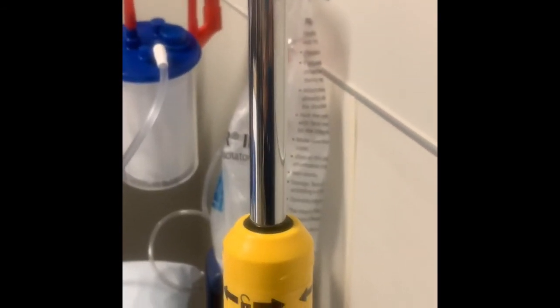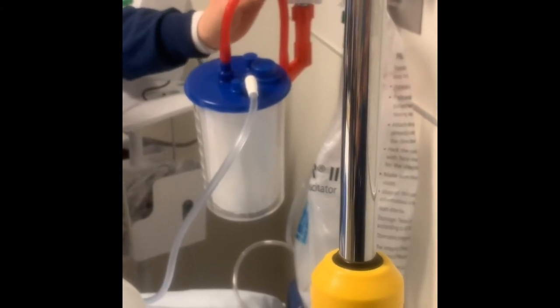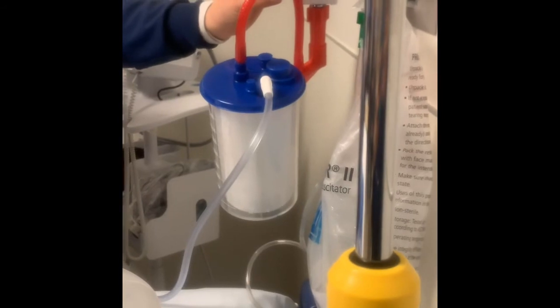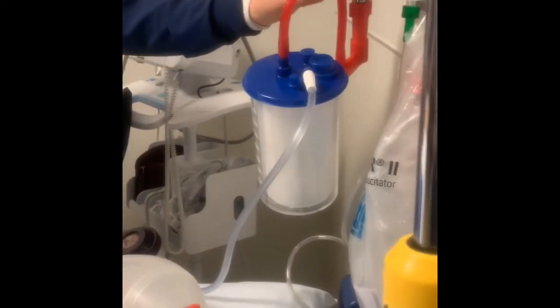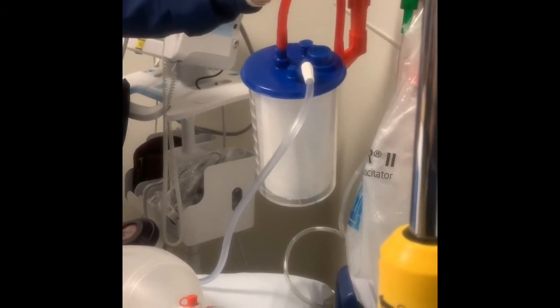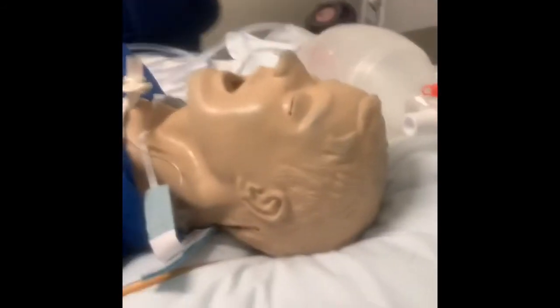Go ahead and turn it on. Make it real life. Everything before. Okay, so no more than 150. On that little sheet you sent me, I thought it said 120 was optimal. Is that right? 150. Okay. So if you watch clinical skills, it's 150 or less. But you don't want to go too low, because then you're not going to be able to suction. I'd say about 150 is where you want to be.